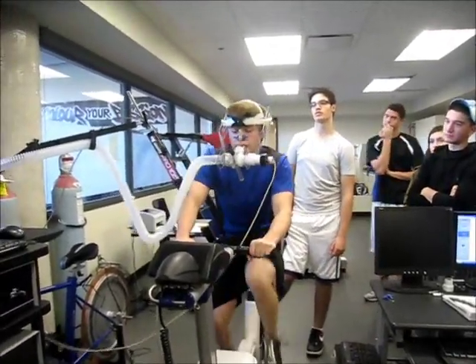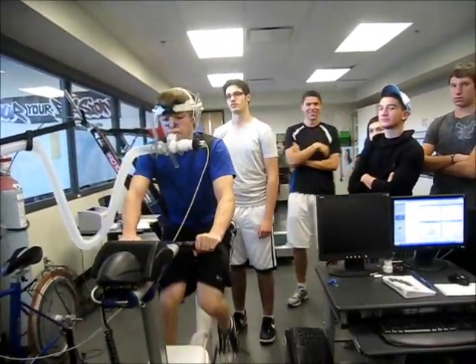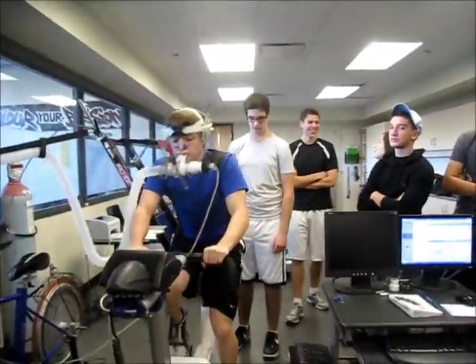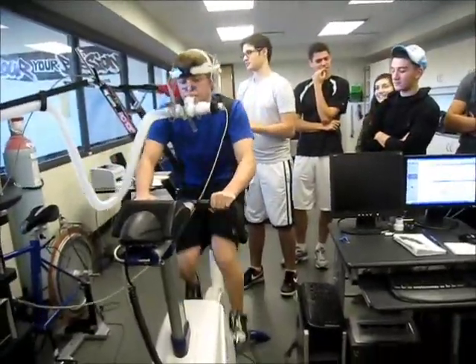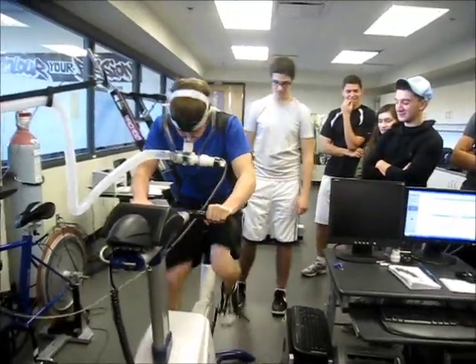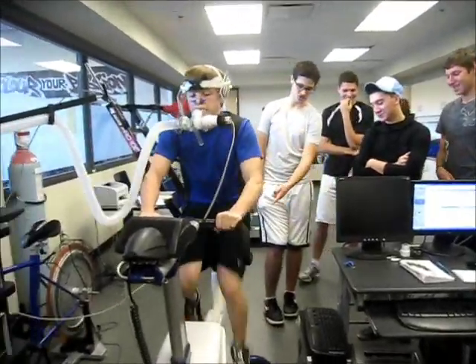Heart rate is around 195, so he's working hard. Good job Daniel — we're at 250 watts. Keep going!